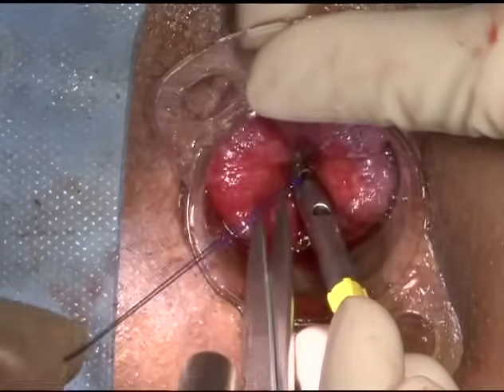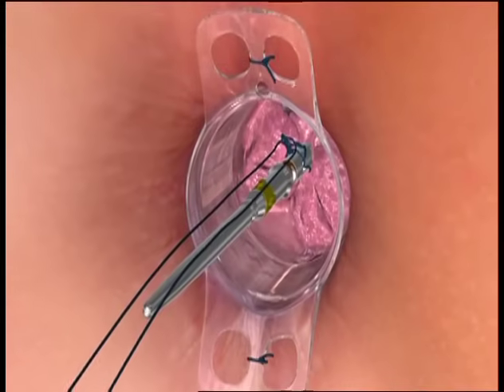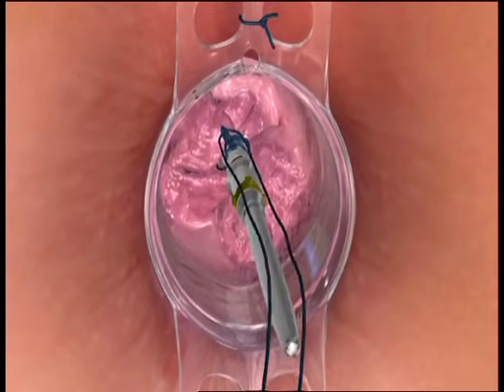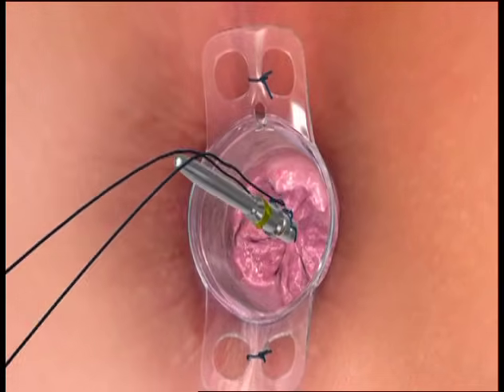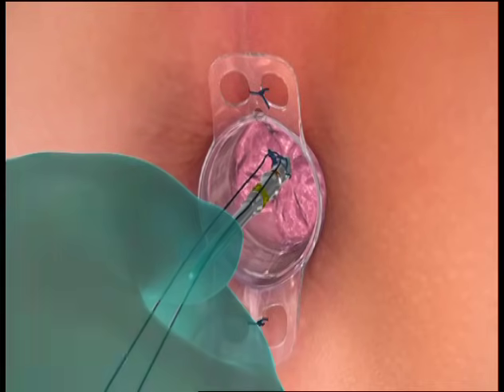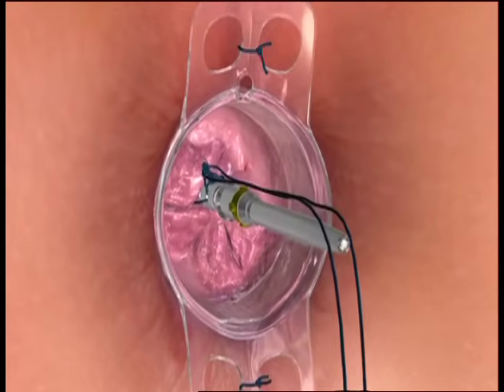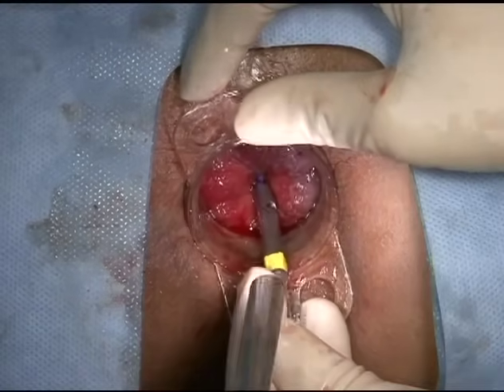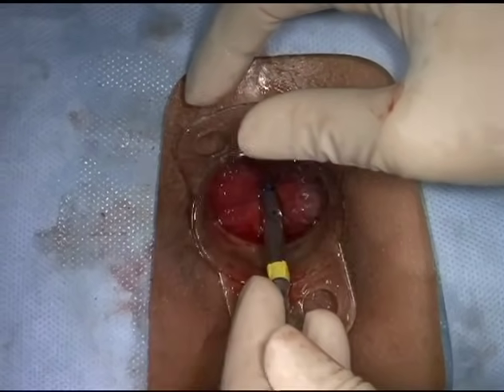Cut and remove the excess purse-string. Add gentle traction to the center rod while checking to confirm that all desired tissue has been gathered, that no unwanted tissue has been incorporated, and that there are no gaps in the purse-string. On female patients, digitally inspect the rectovaginal wall while moving the anvil assembly slightly in and out to ensure that the rectovaginal tissues have not been incorporated. Remove and reapply the purse-string upon discovering any gaps that would result in an incomplete anastomosis or if unwanted tissues have been incorporated.